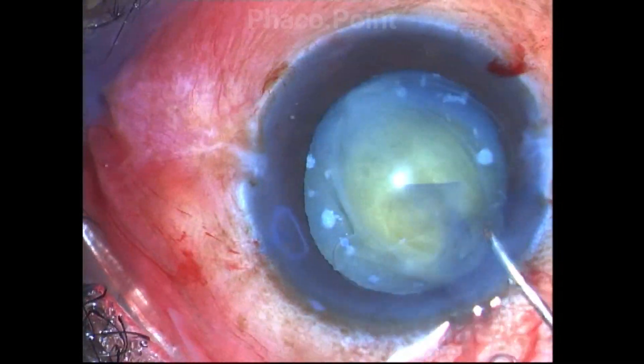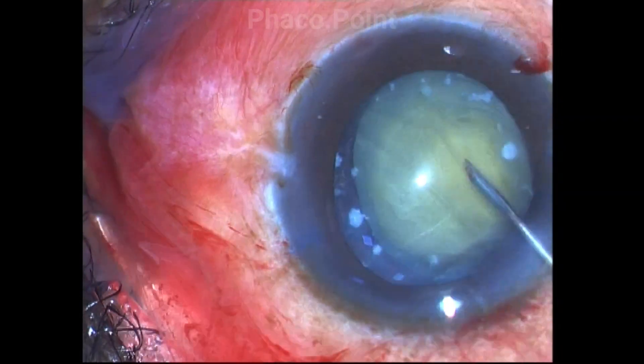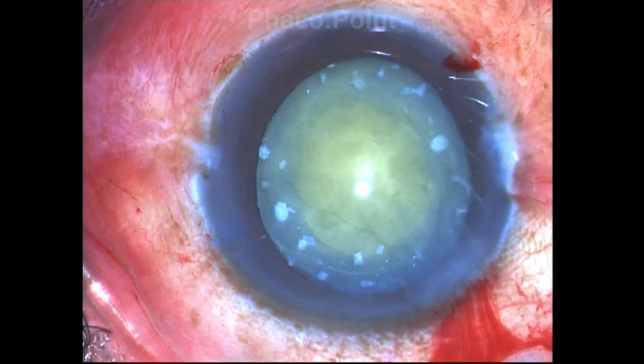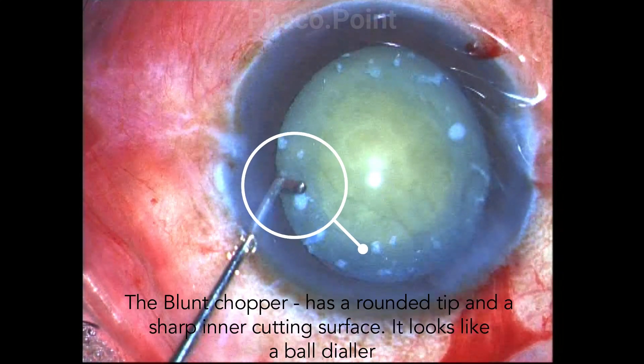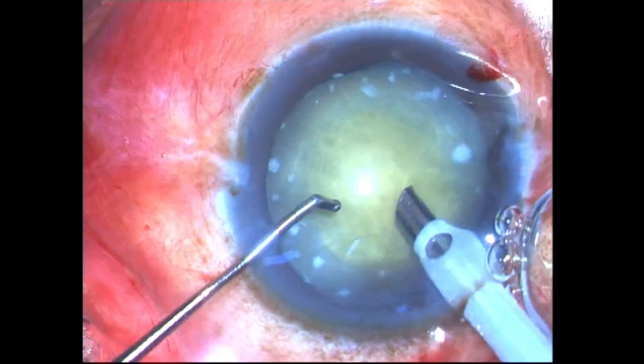Hydrodissection is not needed, but the reason why I use a jet of fluid is to wash off the liquid cortex. Now this is a very important instrument that I am using — this is known as a blunt chopper. It has a blunt end at the tip and a cutting edge on the inner side. It looks similar to a ball dialer.